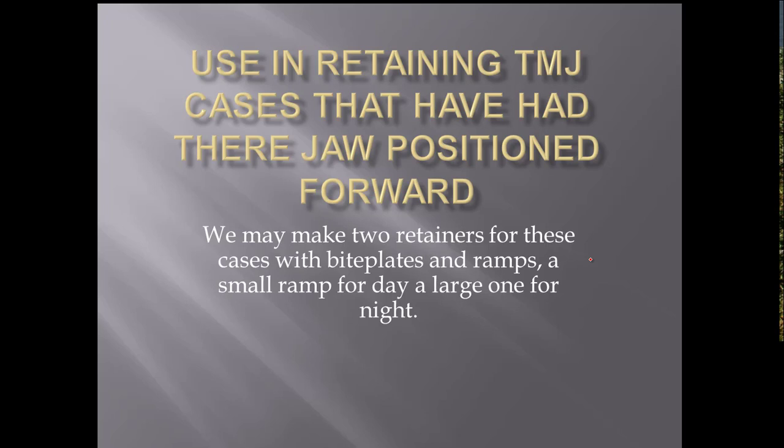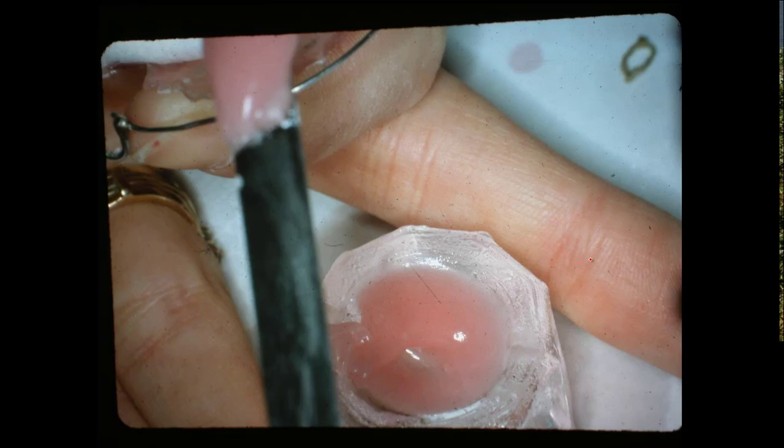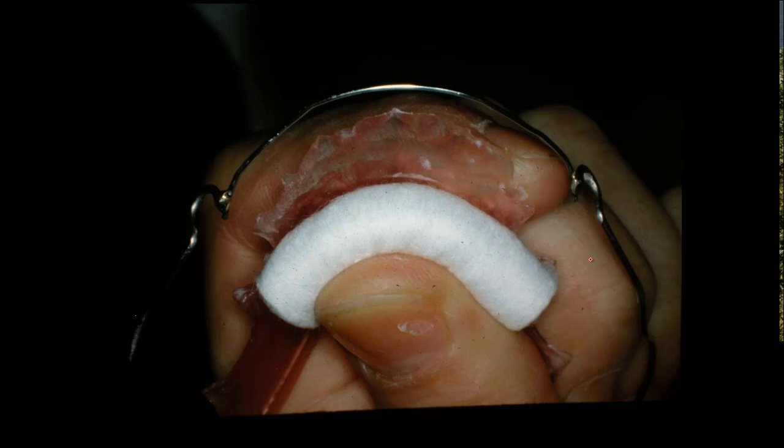So we wear that one at night. Now here we're going to show you how we do the ramp. You have the retainer finished with the wraparound wire that goes around — nothing goes over the occlusion. I want the teeth to erupt into each other and just wear in at that place. So we take a retainer that's been made and they've worn it for a while, and then we come in and mix a little acrylic and liquid. You put a cotton roll right into the retainer and kind of rough up the bottom of the retainer. Now you're going to put this soft acrylic on, but you've got to be able to move it around — you don't want any of this acrylic to get on the tissue side of the retainer.